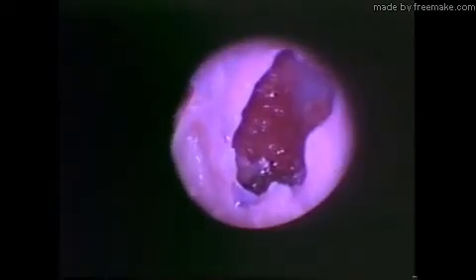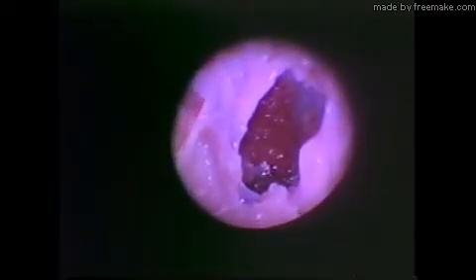Can I have the straightforward Blakesley again? No, hot water would take too long. So I'm going in with the Blakesley and try to remove the ice. Yes, there we go. You can see the crystalline structures of that.